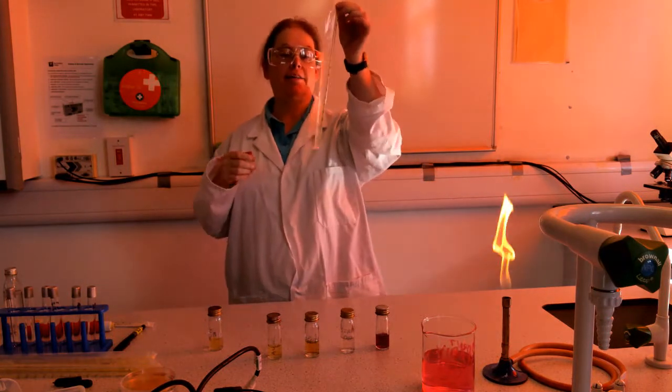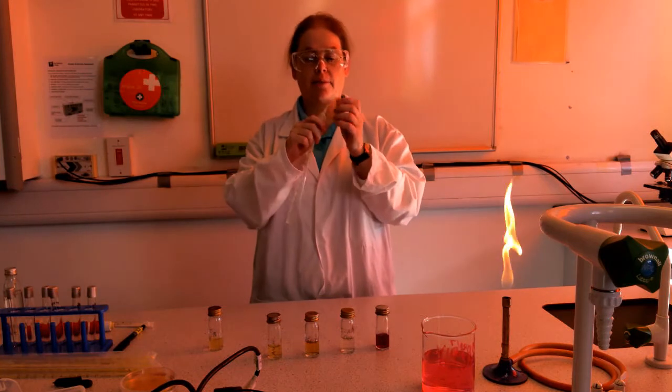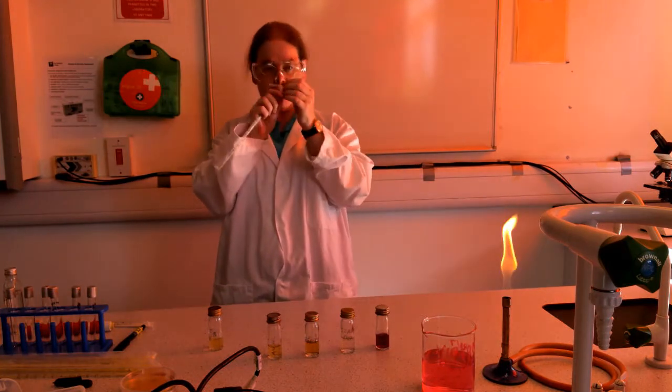So we have here some sterile graduated pipettes. They're sterile till they come out the pack.